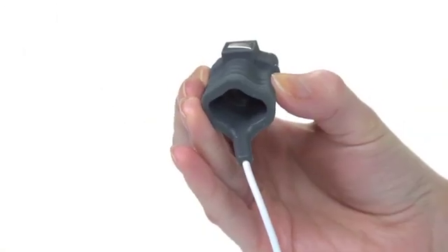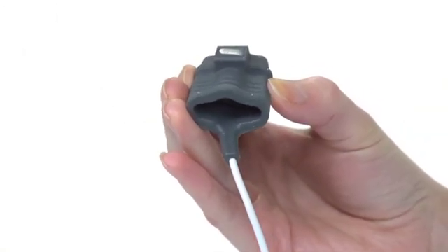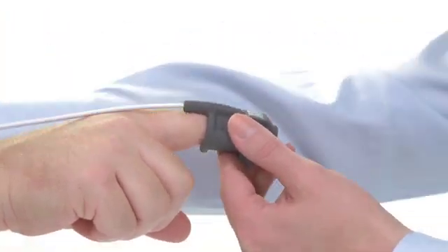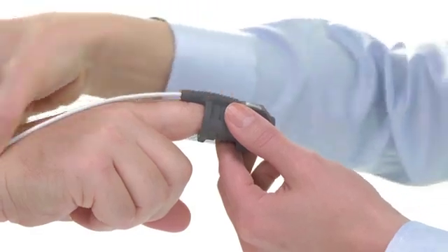Simply give a gentle squeeze on the sides of the sensor to gap it open and insert a clean, dry finger into the end of the sensor. Place the cable to run along the top of the hand toward the wrist.